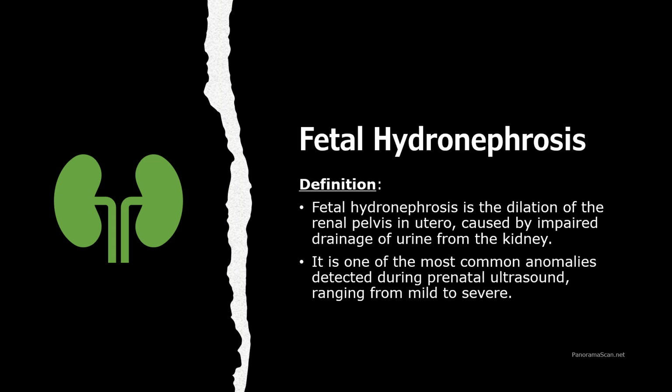The degree of dilatation and whether it affects one or both kidneys can provide important clues regarding the underlying cause and potential complications. While many cases are mild and resolve without intervention, it is essential to monitor the condition closely throughout pregnancy to ensure the best outcome for both the fetus and the mother.